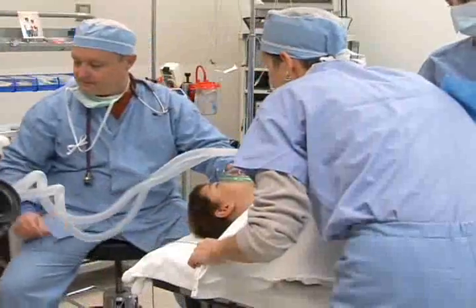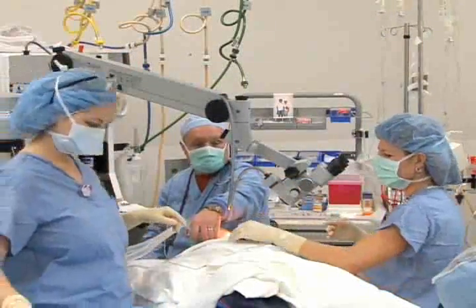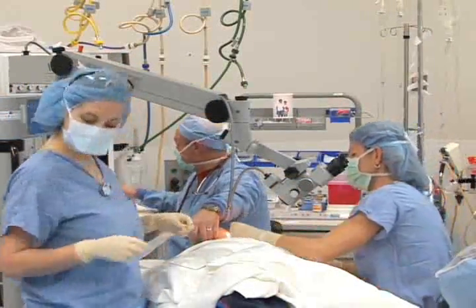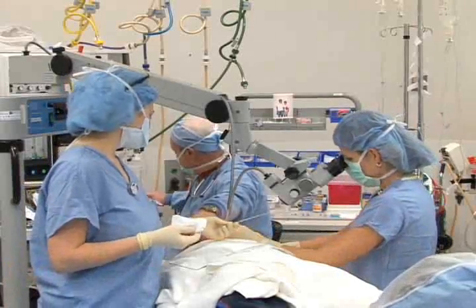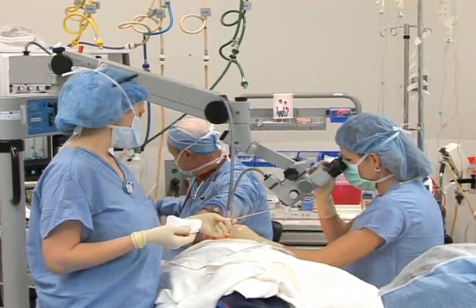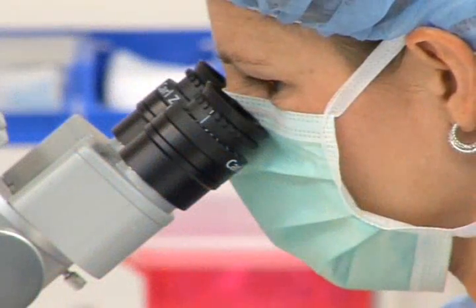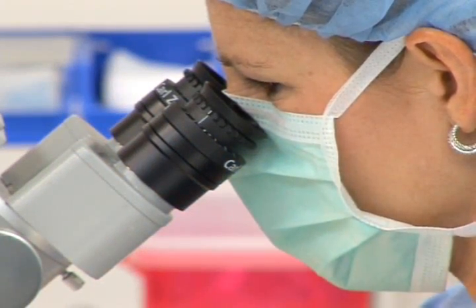The anesthesiologist places a mask over the patient's face in which they breathe inhalational gas, and they are off to sleep within just a few seconds. At this point, the patient's placed on their back in preparation for the procedure. This procedure is performed using a microscope because the eardrum and all the other structures are very small. The microscope is brought into view and focused on the patient's ear.